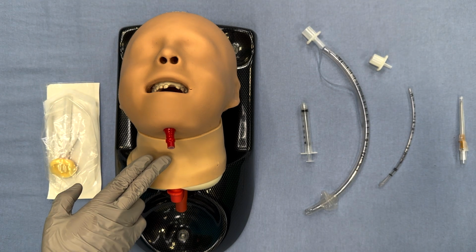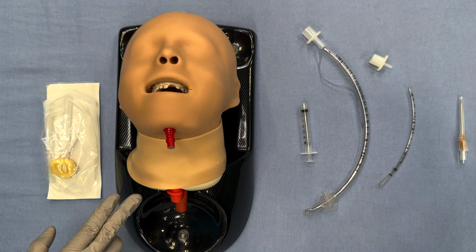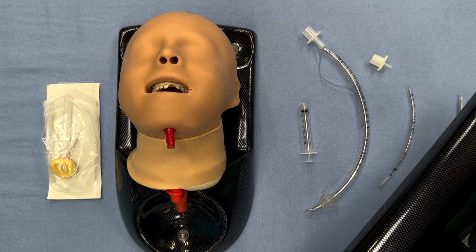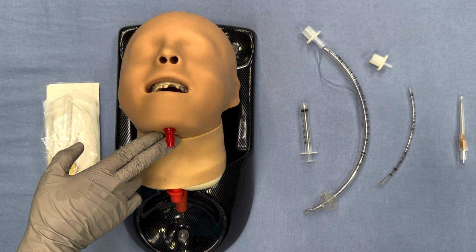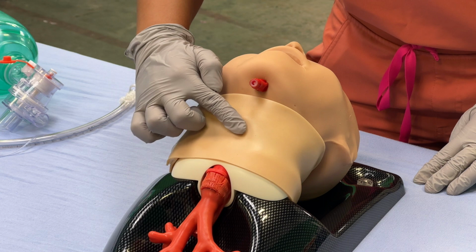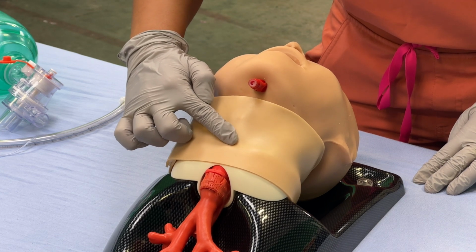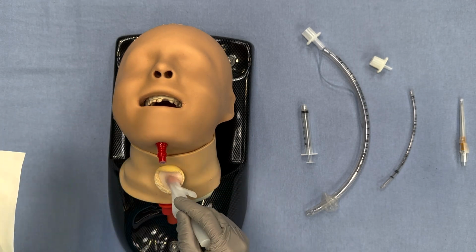First, I'll palpate to find the cricothyroid membrane. One thing that's important to know is that the thyroid cartilage is less prominent in children. In an adult, I'd palpate down from the thyroid cartilage, but in a child, it might help to palpate up from the sternal notch and over the cricoid cartilage until I find the right location. I'm feeling for a dip between the thyroid and cricoid cartilages. Now that I've located the cricothyroid membrane, I'll prepare the neck with antiseptic solution.